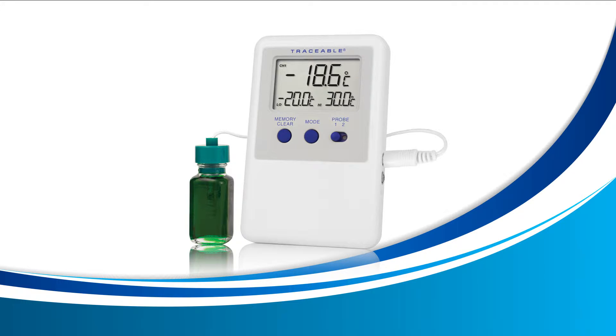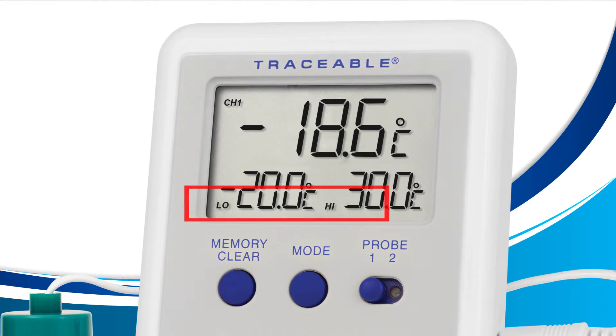Let's get started viewing your current high and low alarm. For this lesson we're only going to use the mode button located on the front of your device. Press this button until your screen displays the words high and low as shown here. Once you see high and low, you're all done — you are now in alarm display mode viewing your current high and low alarms.